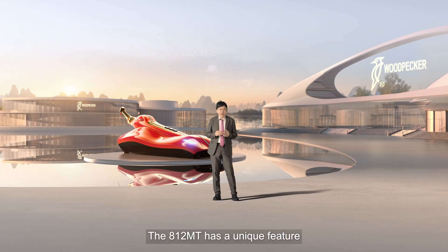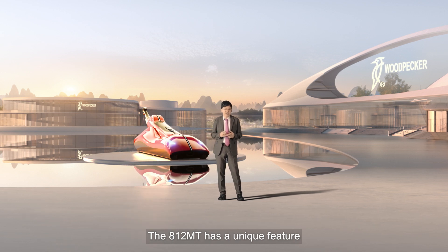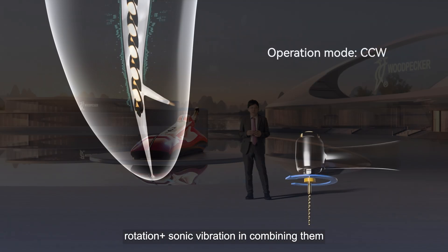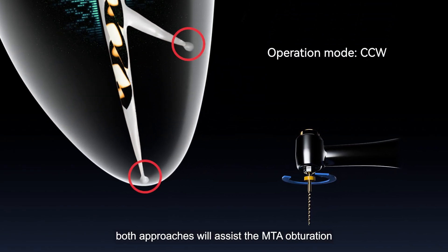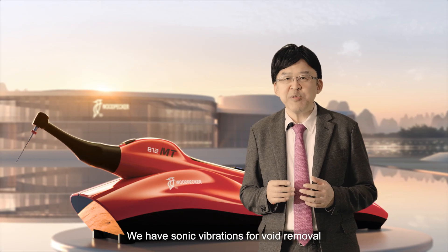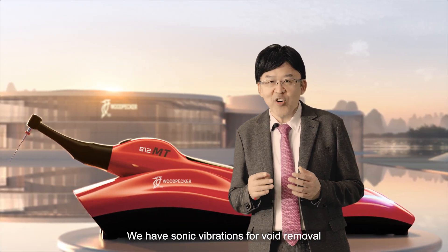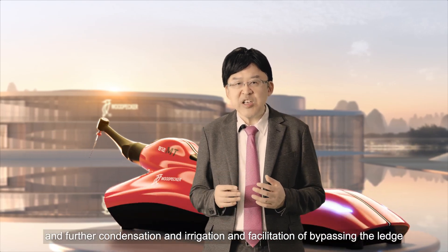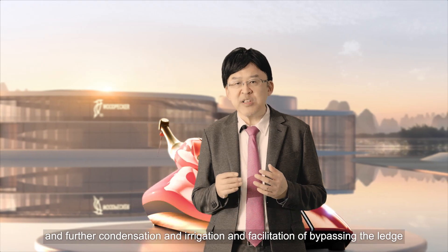The 812 MT has unique features — rotation plus sonic vibration. By combining them, both approaches assist MTA obturation. We have sonic vibrations for void removal, further condensation, irrigation, and facilitation of bypassing the ledge.